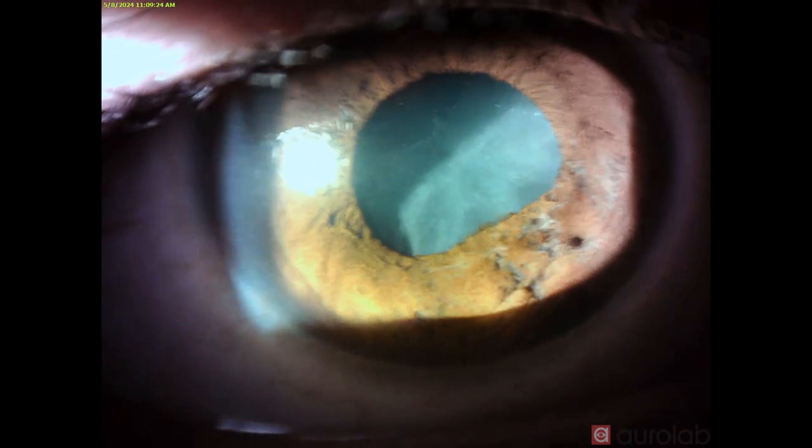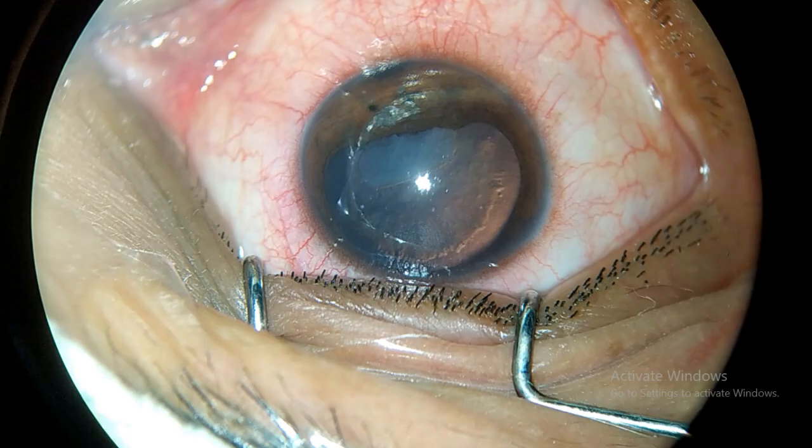Hello friends, in this video we present to you a case of a young patient with traumatic cataract and inferior nasal iridodialysis. The anterior capsule has fibrotic changes. There is presence of posterior synechiae at the inferior pupillary area.